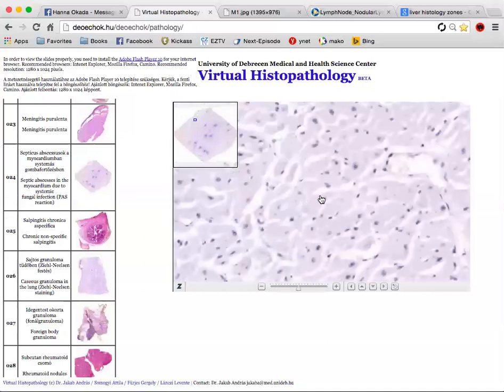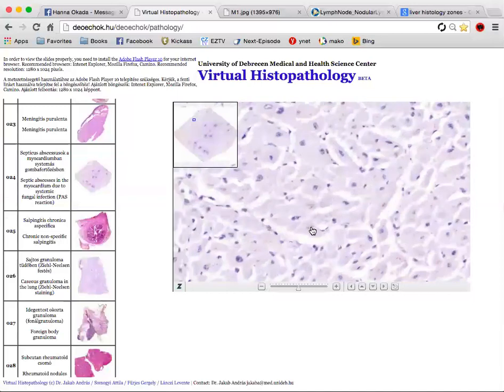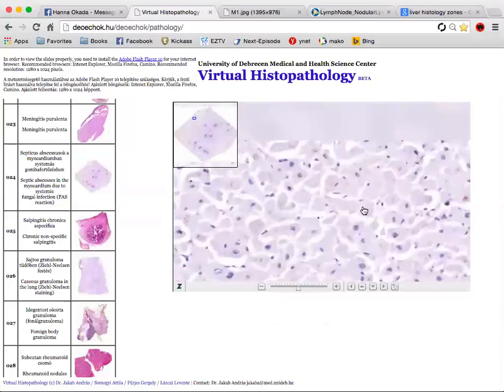I just want to show you this. You see all this brown pigment? This is lipofuscin. And there may be some atrophy here with the muscle. I just want to show you because fungal abscesses would not happen in a person with a good functioning immune system.